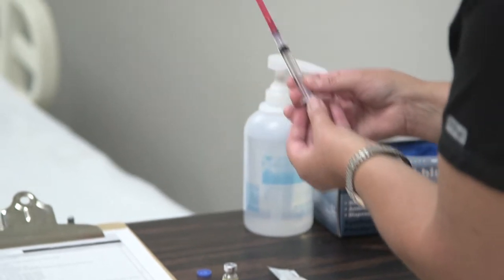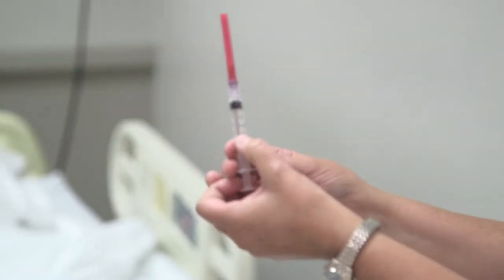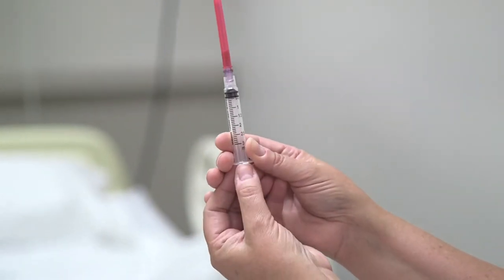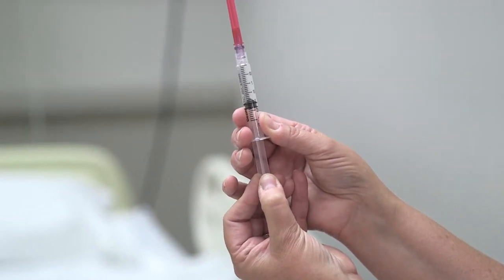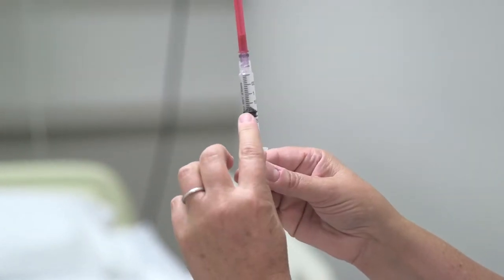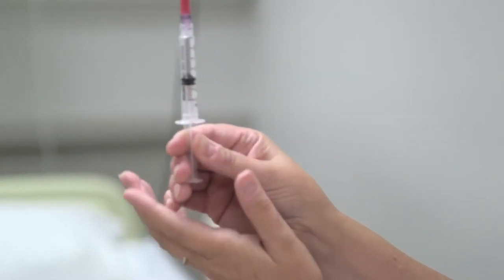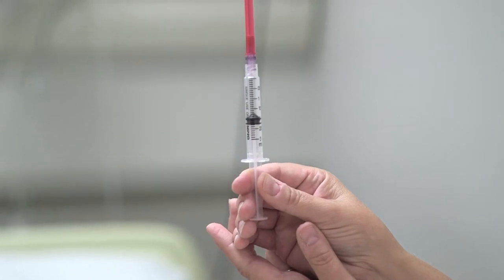And then now that I know that I'm giving 2 ml of the medication, I'm going to go ahead and draw up my air, because I'm going to put air in first. So you're going to draw up the 2 ml of air, which is equal to the amount of volume I'm going to give the patient. And when you read it, you want to read the top black line. So we're at 2 ml. Okay.